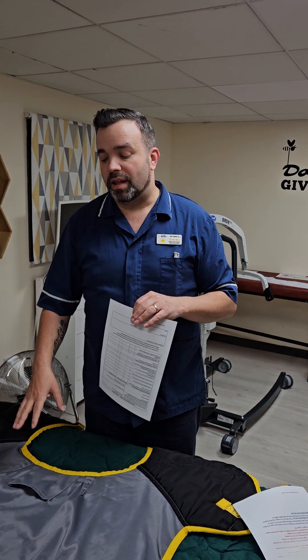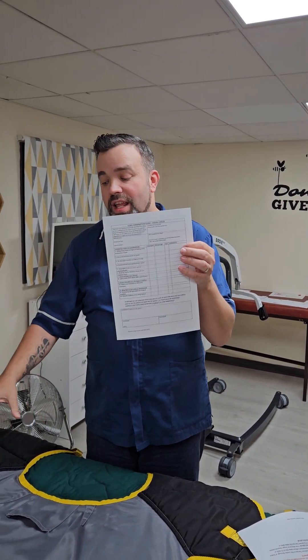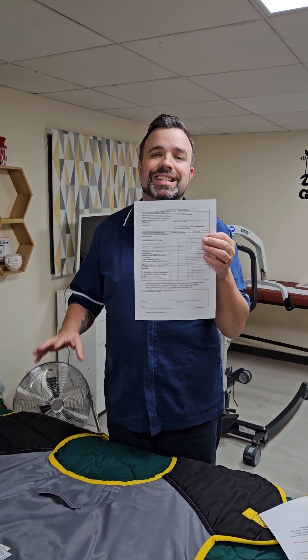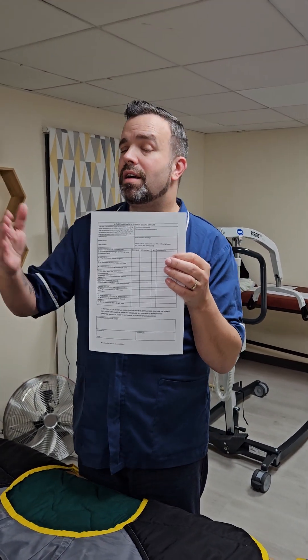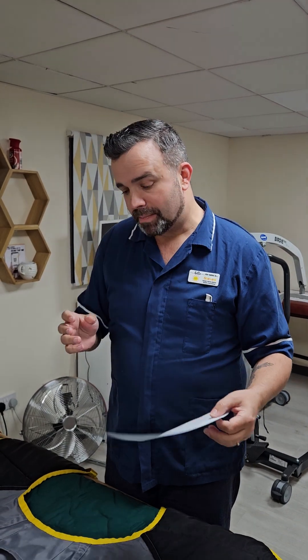Every six months we need to do a formal visual check of the sling, and you need to be completing this form and uploading it into your care note system, to confirm that you've done a visual inspection of the sling and it is still safe to use. That's not to say you're not doing the same checks every single time you use the sling, because from the last time to this time the sling may have frayed. So make sure you are doing these every six months.